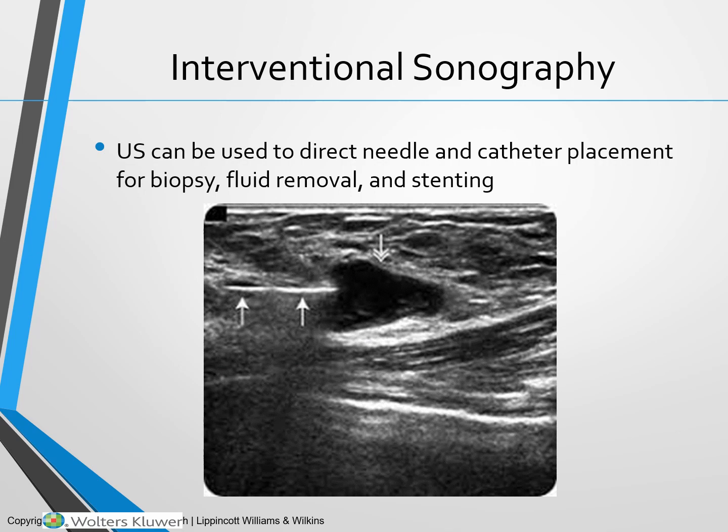So here's an example of a needle that can be seen on ultrasound, and this is being inserted into a breast mass. So that way, when the physician is doing the biopsy, they are able to directly see and tell that the sample being taken for the biopsy is right in the mass or where they want it to be. The advantage of using ultrasound for interventional procedures is that we can image in real time as well.